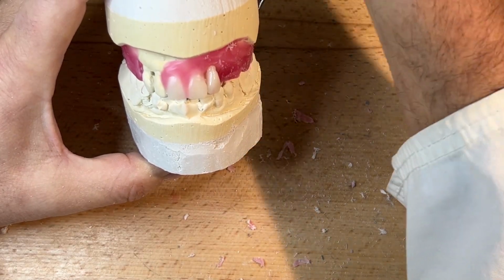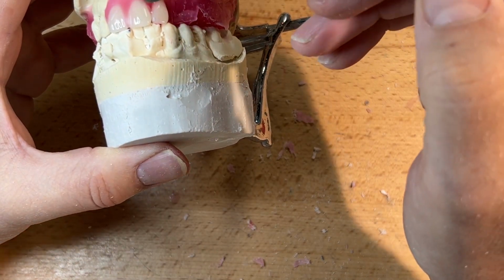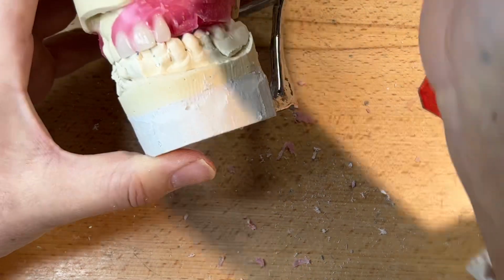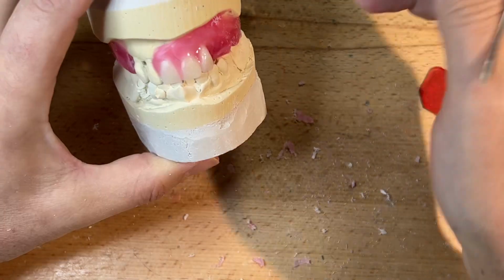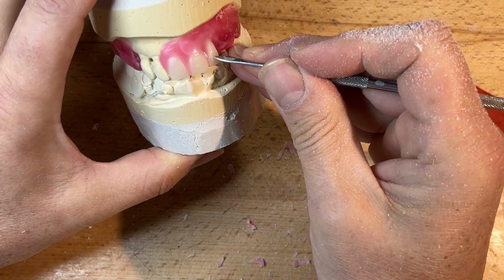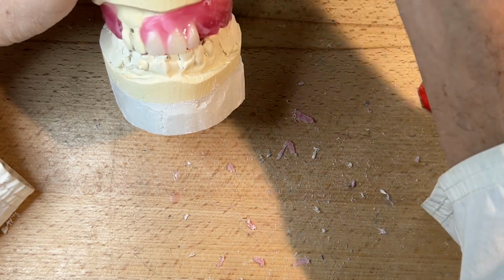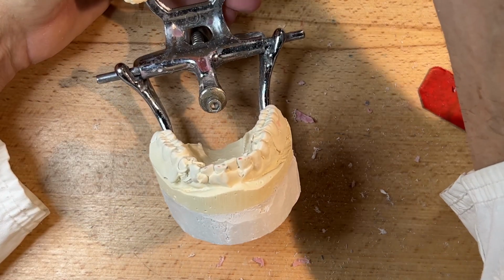I don't know if this client is right-handed or left-handed, but the majority of people seem to be right-handed. So you can have this right side dominance if you wish to include in your setup. And we'll make the left side a little bit softer. And we'll move on to the canine.